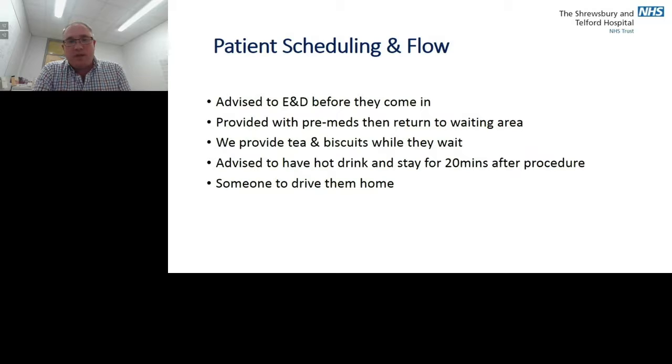We do encourage everyone to eat and drink as normal prior to coming in for the procedure. We provide them all with the pre-meds, which we'll go on to shortly, whilst they're in the waiting area. And then we provide them tea and biscuits while they're waiting for the procedure too, to try and relieve some anxiety. In the waiting room, we also have a TV on and some magazines available.